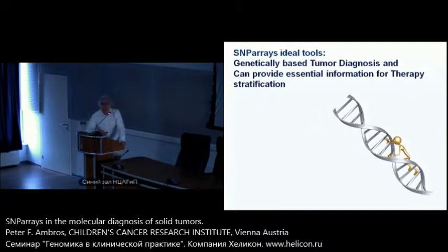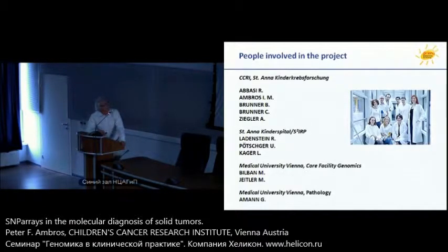I hope I could convince you that SNP arrays are helpful to decide the appropriate diagnosis, and also importantly to give very accurate information to the treating physician about the outcome of this patient. And last but not least, the group I'm working with, Reza, is doing a lot of bone marrow analysis, so we can also isolate tumor cells from the bone marrow, and do SNP arrays, looking for the development of the tumor cells.